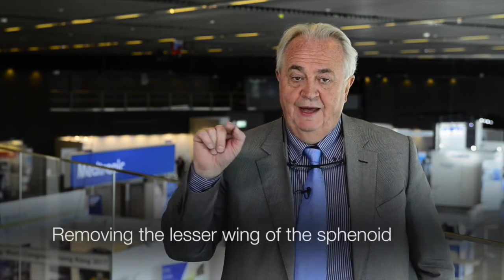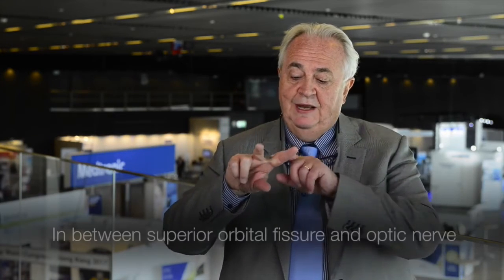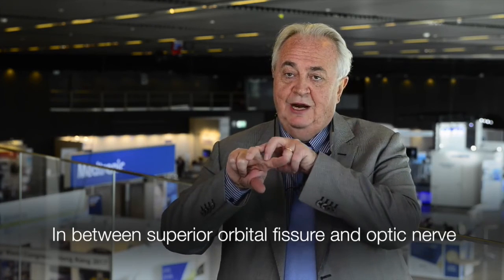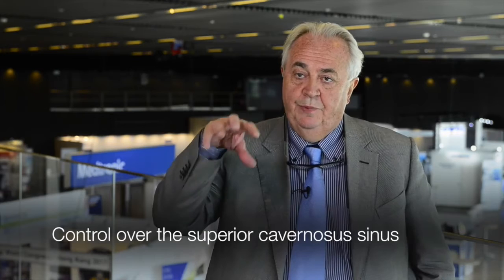If we remove the lesser wing of the sphenoid, that is in between the superior orbital fissure and the optic nerve, we get control of the superior portion of the cavernous sinus. So we can approach the floor of the middle cranial fossa, and then the lateral wall of the cavernous sinus.